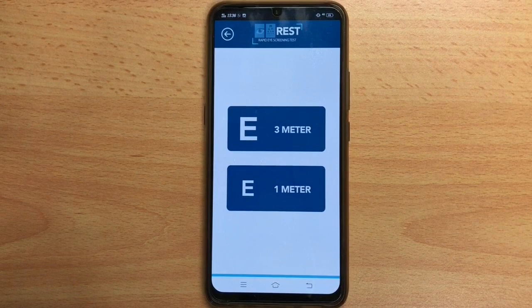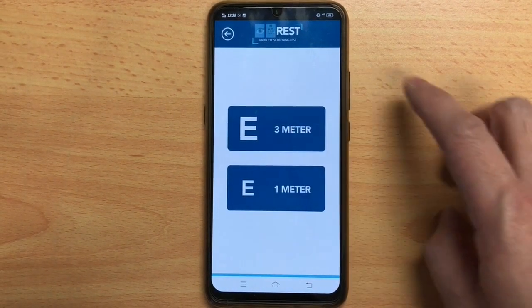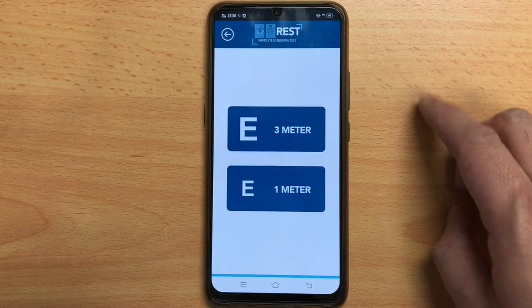There are two ways to use this app: a 3m or 1m chart. Notice how the screen is being swiped by the user.